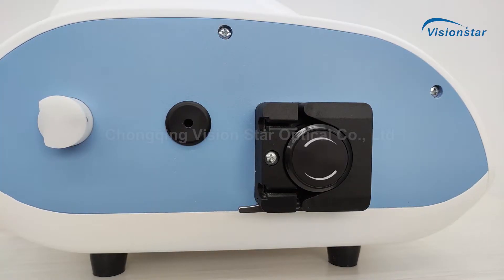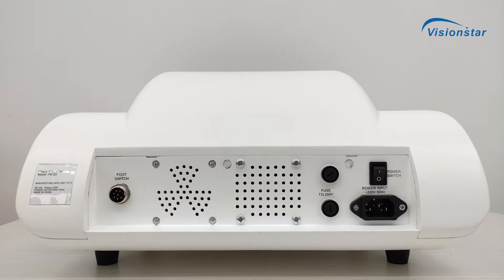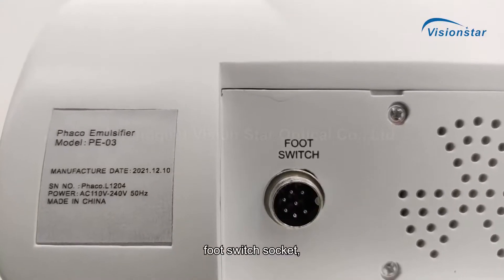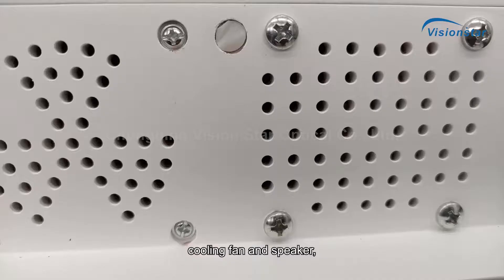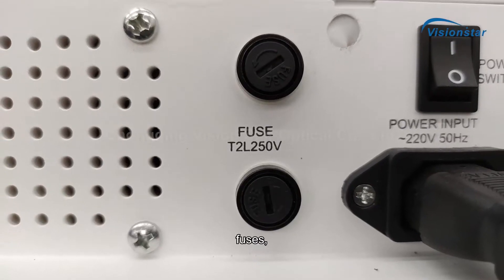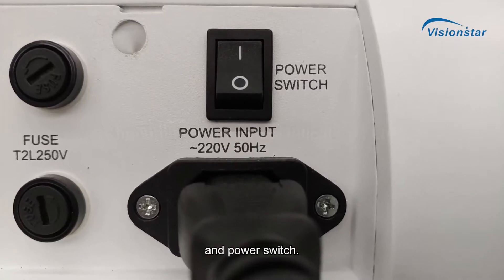It features a peristaltic pump, foot switch socket, cooling fan and speaker, fuses, and power switch.